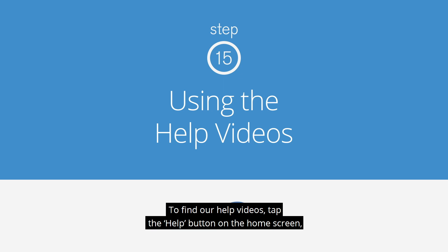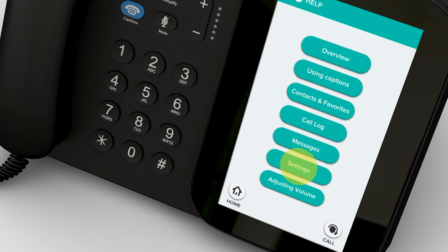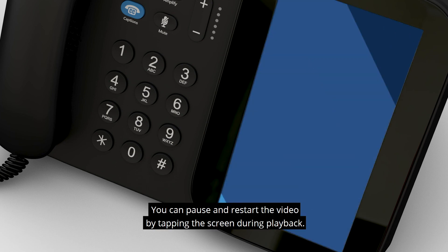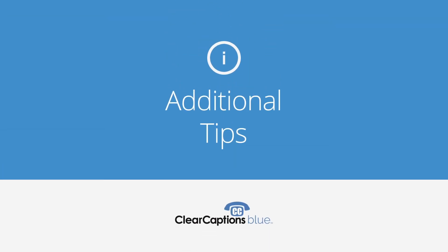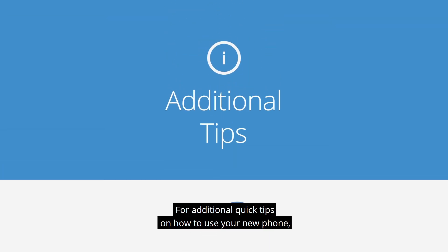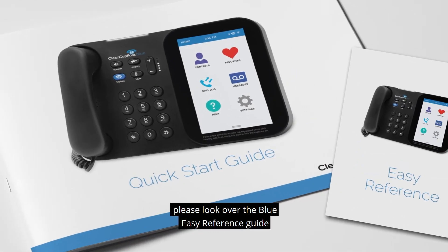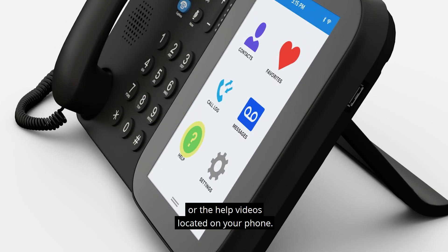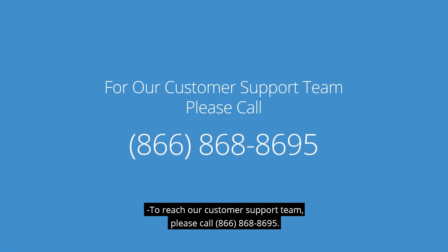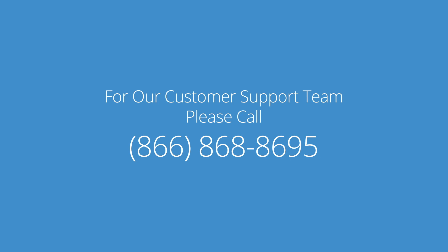To find help videos, tap the Help button on the home screen, then tap the topic you want to play. You can pause and restart the video by tapping the screen during playback. For additional quick tips on how to use your new phone, please look over the Blue Easy Reference Guide or the Help videos located on your phone. To reach our customer support team, please call 866-868-8695.